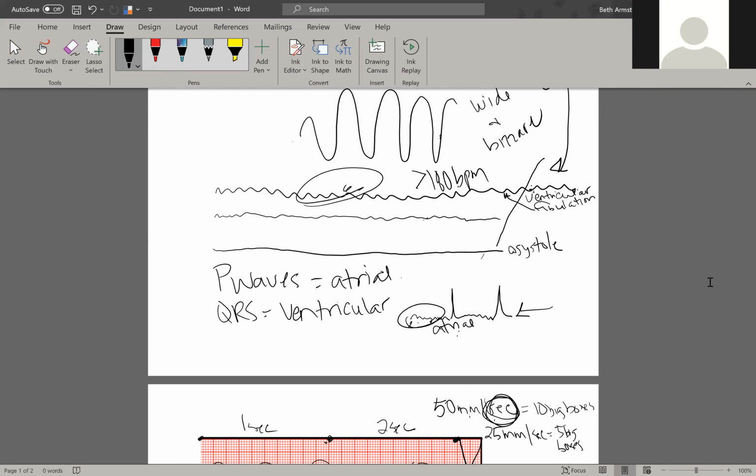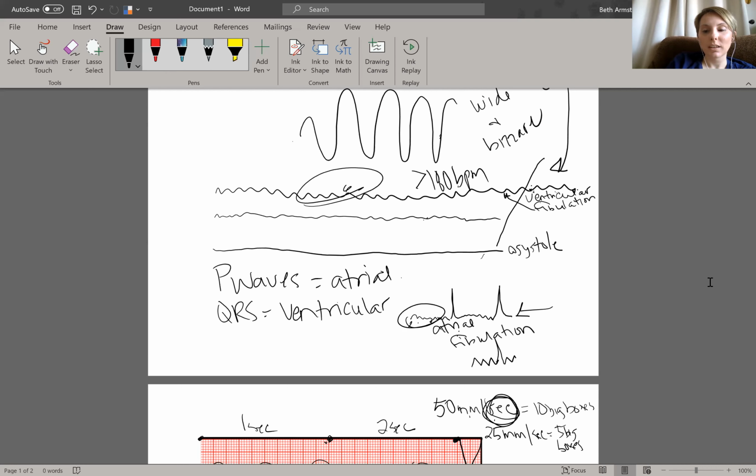Atrial fibrillation. Atrial fibrillation. Good. Now, what would this be? Ventricular. Ventricular or atrial tachycardia.